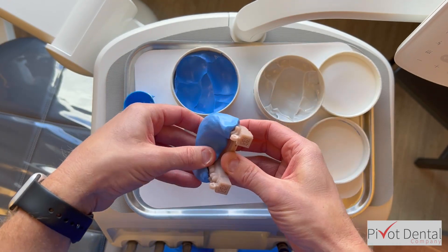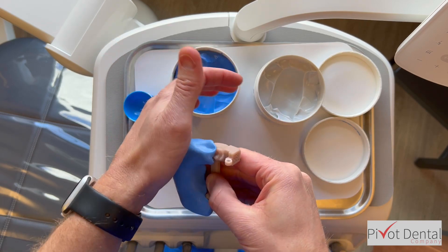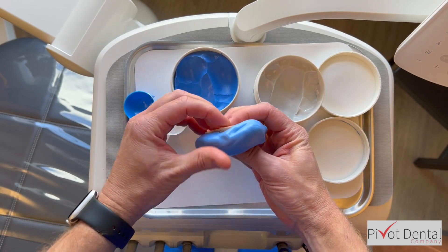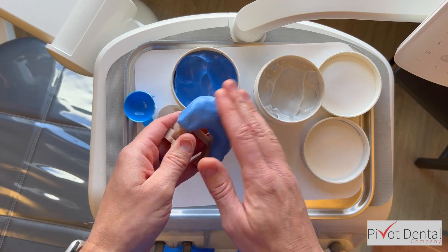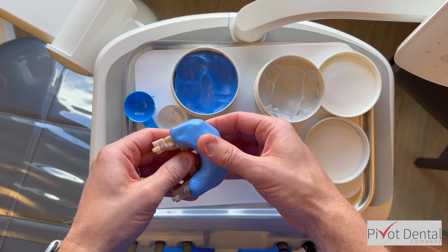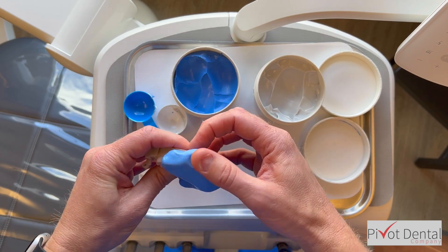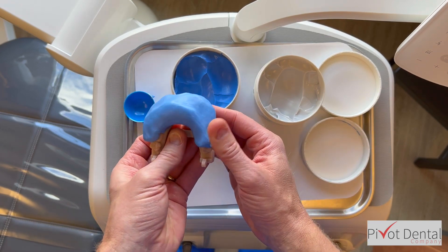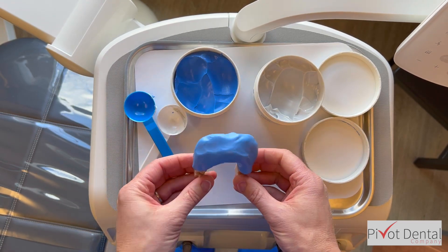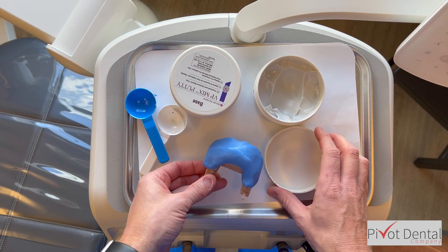I kind of guessed on how much volume to use, but now that I'm putting it in place, I'm pushing from the lingual, across the occlusal or incisal surface, and pushing any excess out toward the facial. Later when I trim the excess, it'll be much easier from the facial to make that work. Now I'm just working it into position and letting it set so I can come back and trim it.